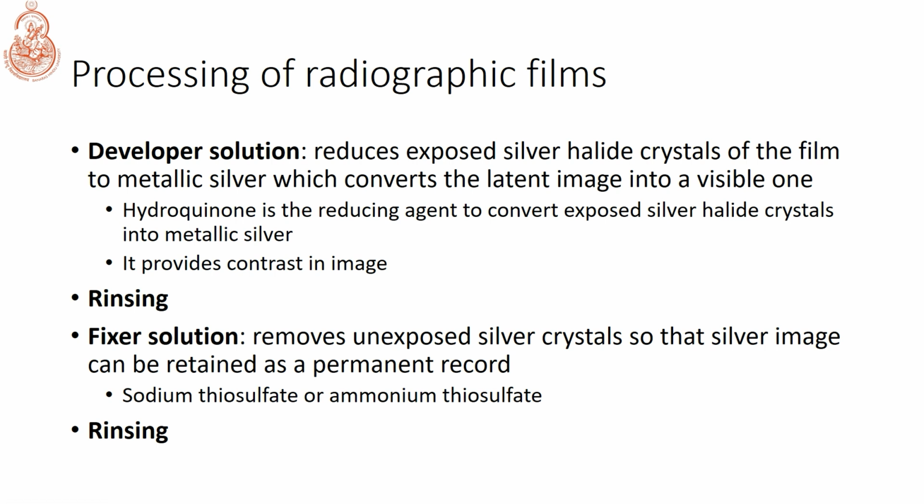But at this moment, I really doubt the locations where conventional radiographic processing is still being done. Most places have changed from conventional radiographic processing to the digital radiographic technique. In the digital radiographic technique, the processing of the radiographic film has no relevance.